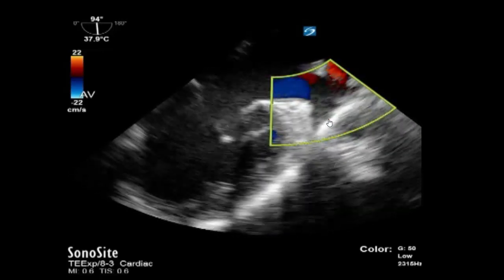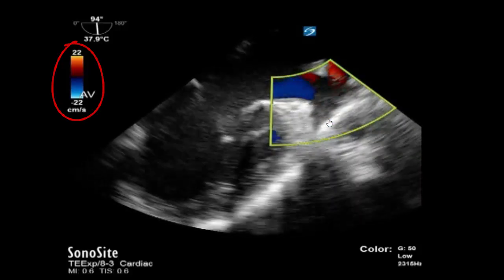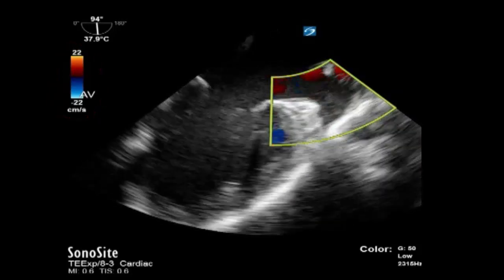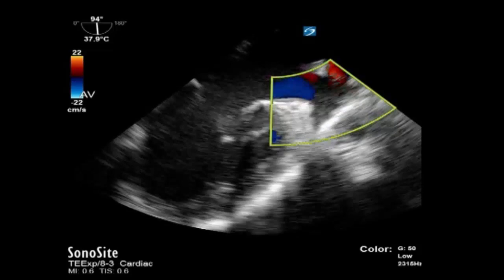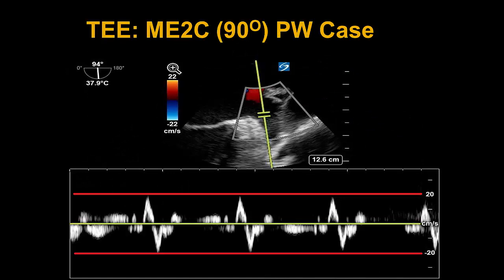We then put our color box over the left atrial appendage with the Nyquist turned down to 22 centimeters per second, and we don't see a lot of aliasing of color as we saw in our normal example. This is all concerning for a low flow state, supportive of the clot previously seen. Finally, we have a pulse wave Doppler spectral signal from the left atrial appendage of our patient, and the flows do not even meet the cutoff of 20 centimeters per second. This is all non-reassuring and suggestive of a low flow state — with flows less than 20 cm/s, ongoing smoke and spontaneous echocontrast, and visualization of an active clot in the left atrial appendage as an ongoing nidus for further formation.